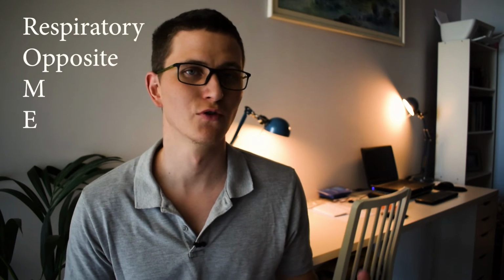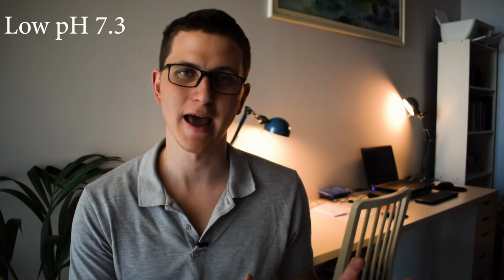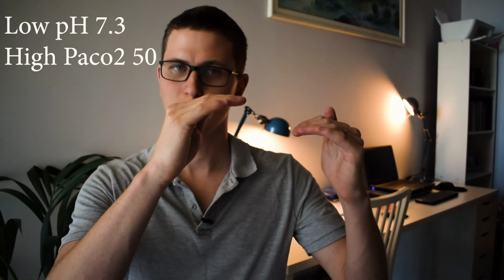So if we look at an acronym called ROME, so R-O-M-E, so RO stands for respiratory opposite, metabolic equal. So respiratory opposite means that if you have a low pH, so 7.3, we have an acidosis, and your PaCO2 is high, they have moved in opposite directions. Your pH is low, but your CO2 is high, so respiratory opposite, you have a respiratory acidosis. The same is true if your pH went up and your PaCO2 came down, you have a respiratory alkalosis.